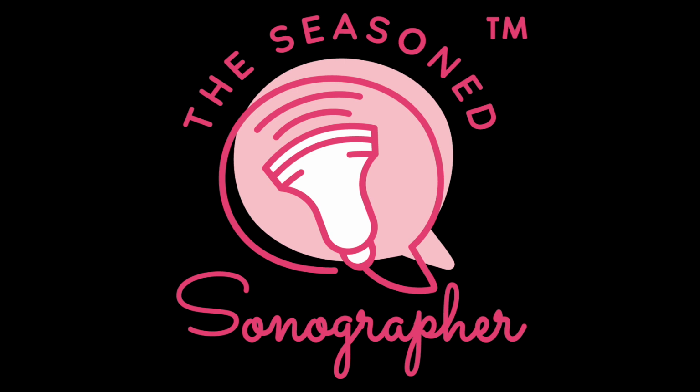Molar pregnancy: that snowstorm or hydropic villi, tiny cystic areas within that endometrium. In a molar pregnancy there's no fetal pole. The endometrium is just full of those cystic areas. And a partial mole, sometimes that can contain a fetal pole, even a viable fetal pole with a heartbeat can be seen. Those pregnancies do likely fail.